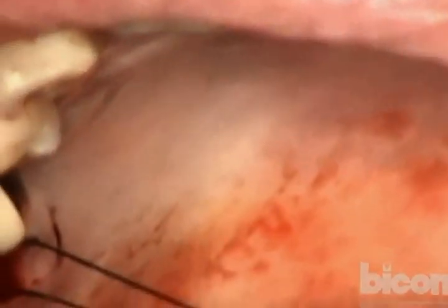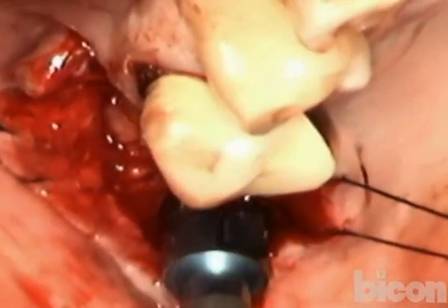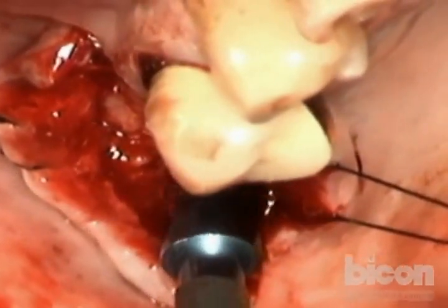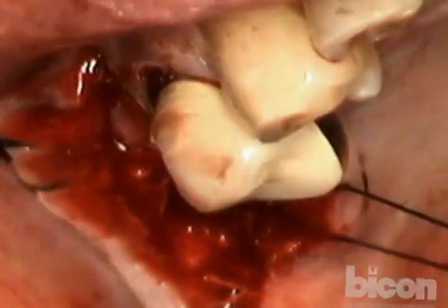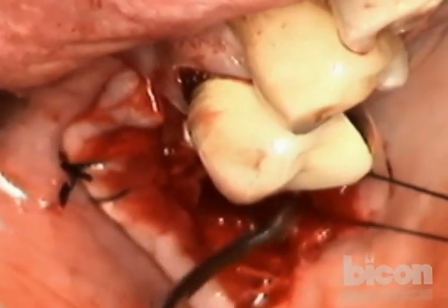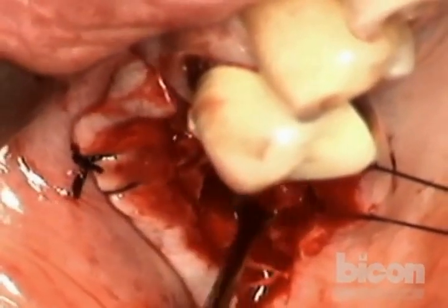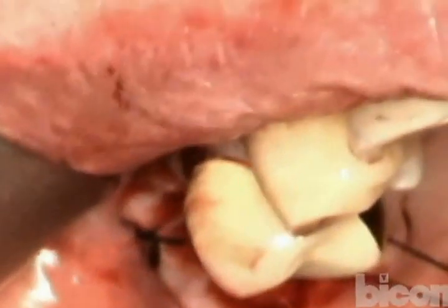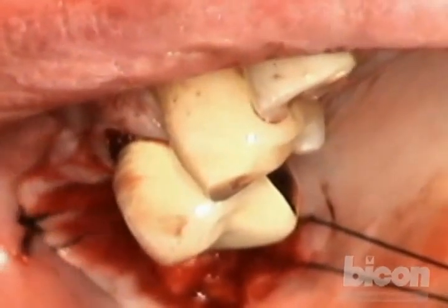Are you okay? I'm getting close to the 90% mark here, okay? I gotta see this here, Chris. Bear with me, buddy. All right, so as you see now, the two osteotomies have merged. Don't suction that, that's the bone. There's a little bit of bone that kind of got left behind. Don't waste anything with the Bicon system, as you know. And this is the final size for the second molar area.